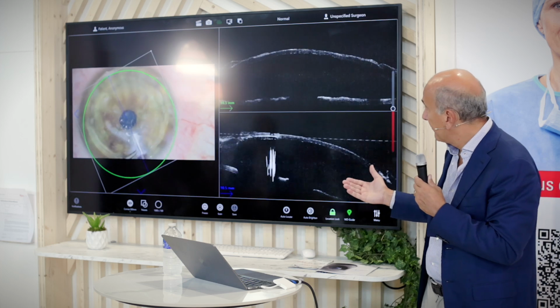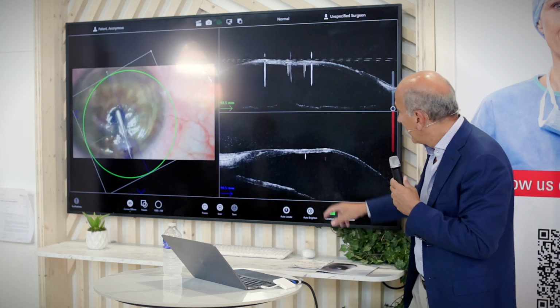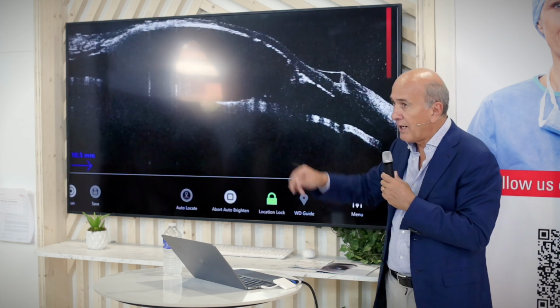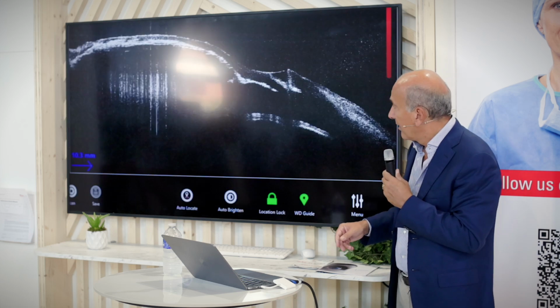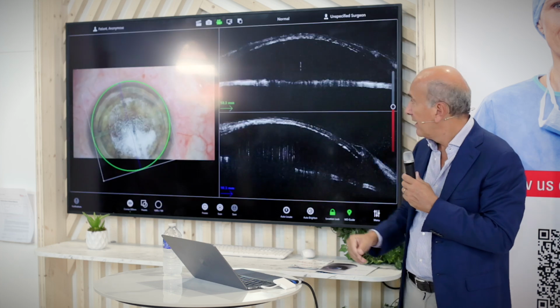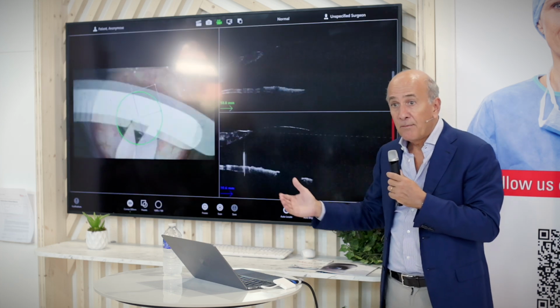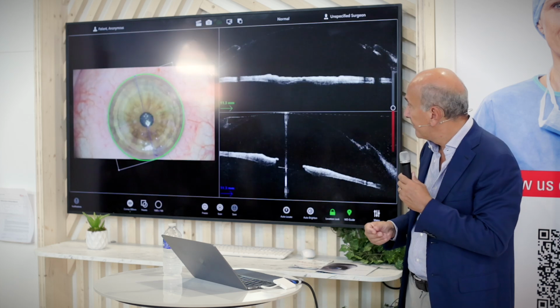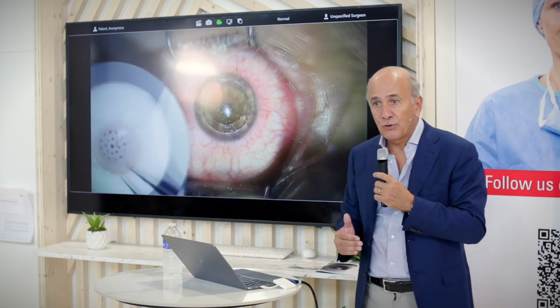And this is the injection of the air in the deep stroma, formation of a large bubble, and this is slashing the bubble, the Descemet membrane comes back, and I excise the stroma and leave basically the pre-Descemet layer exposed, and I put a layer of donor stroma on top.